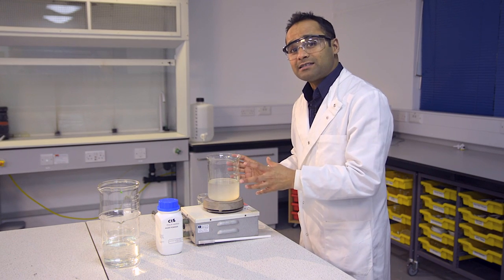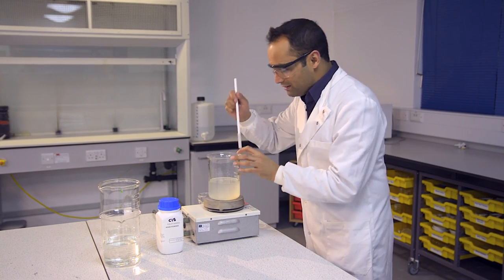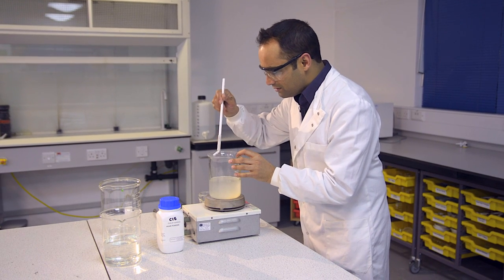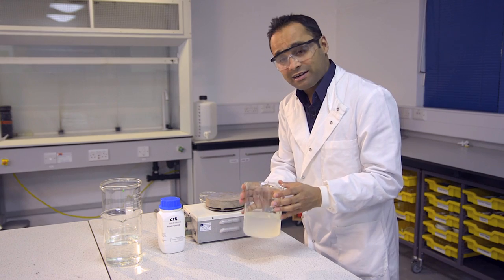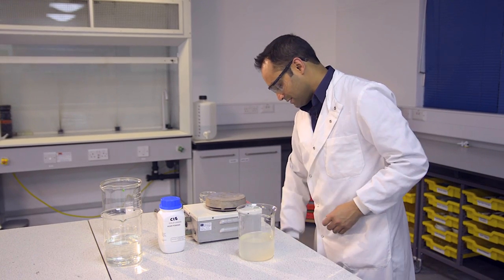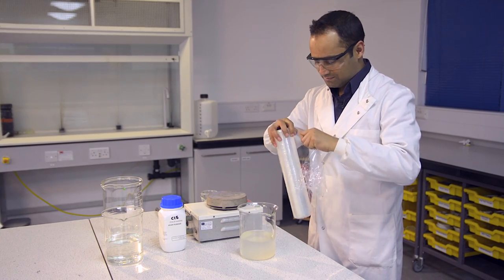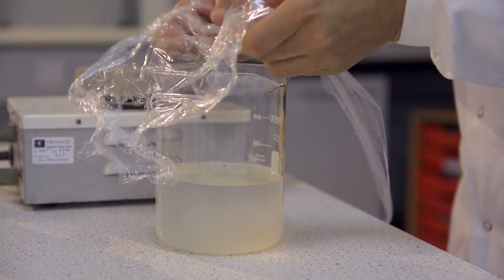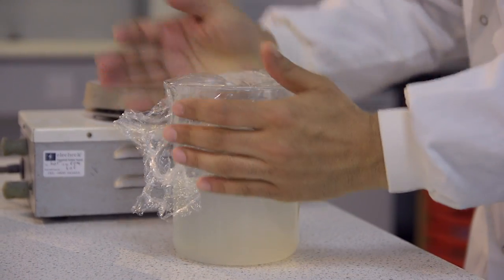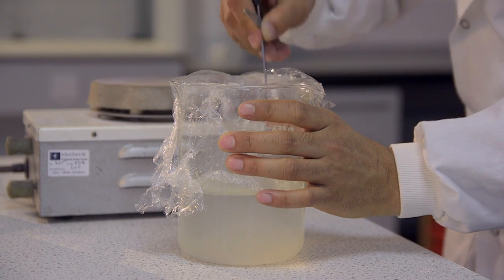So once the agar has had a chance to be stirred thoroughly, remove the flea from your beaker, and then get this ready to heat up in the microwave. That's simply a matter of taking some cling film and covering the top of the beaker, and piercing some holes into it.